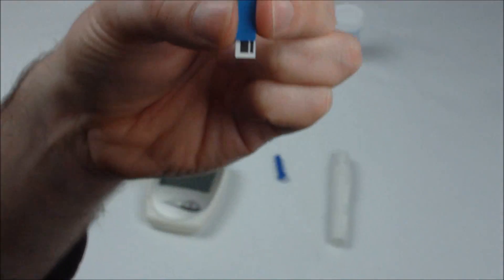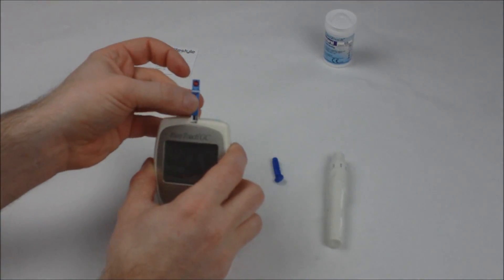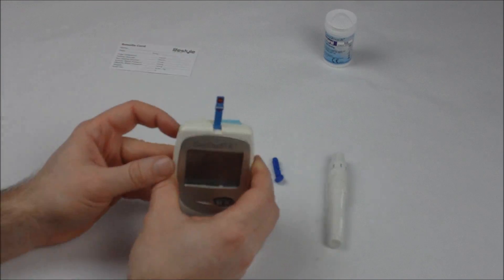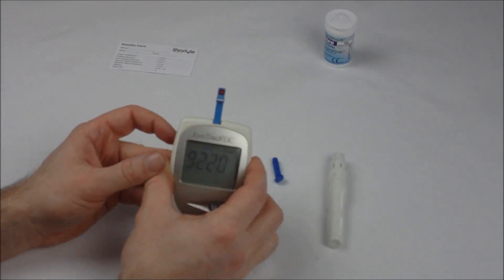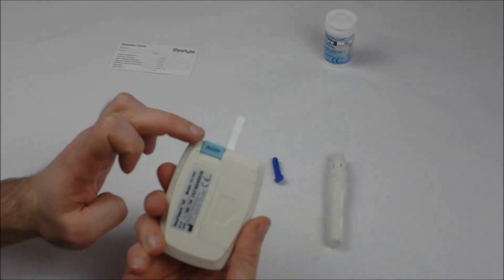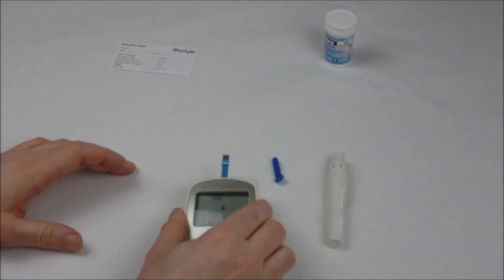Insert your test strip into the monitor in the slot at the top. It will flash a number corresponding to the code key on the back and will display the blood drop symbol.